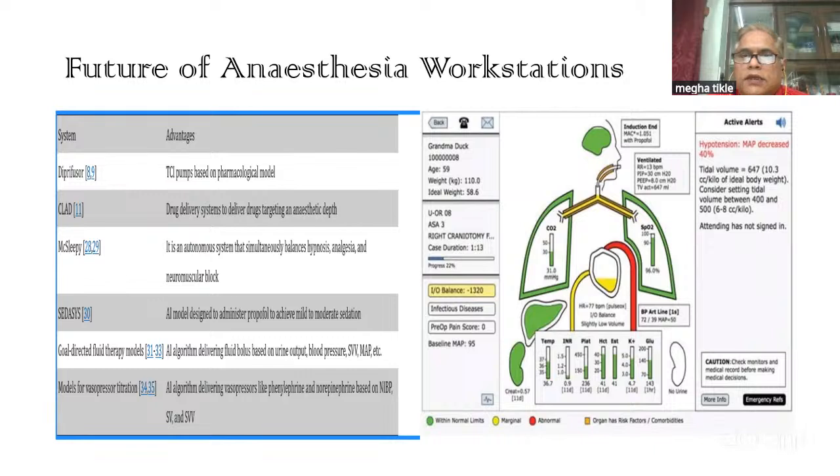Very rarely does the anesthetist need to do some kind of troubleshooting, and mostly it is in case the patient is having some hypoxia, or, as I said, if you are using low flow or very low flow anesthesia, you need to understand that your monitors do have limitations. So you need to look at the monitors, understand what the monitor is trying to tell us, and take corrective steps like switching back to manual ventilation on high flow for some time, then coming back.